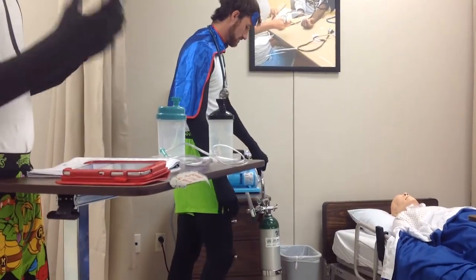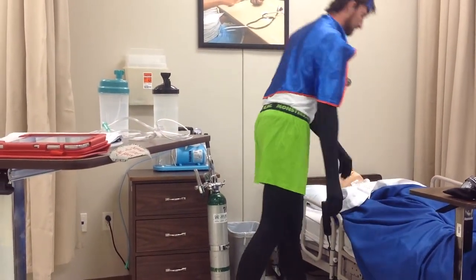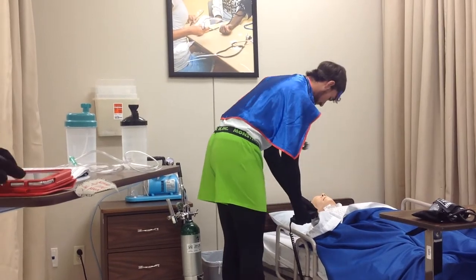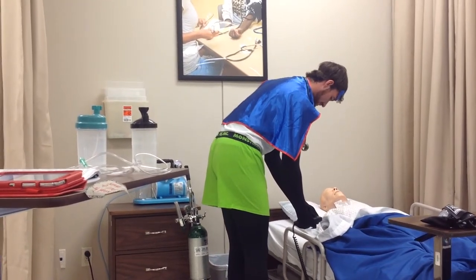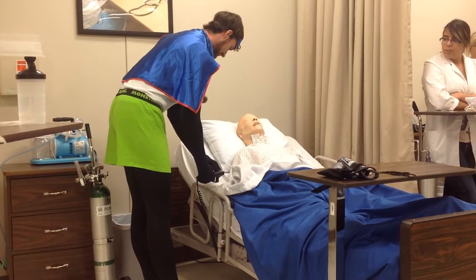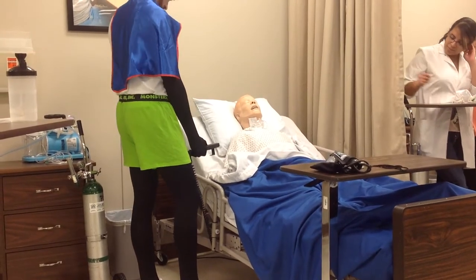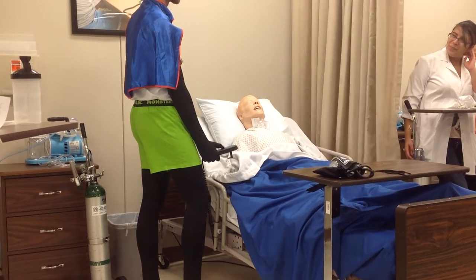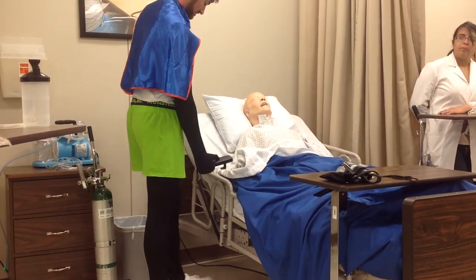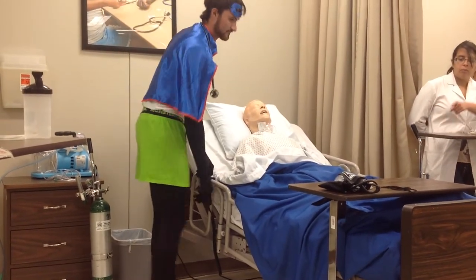So you go in your patient's room, do your hand wash, and use 2 patient identifiers. After all that, the first thing you're going to do is your full respiratory assessment with vital signs. You want to prop them up in a high Fowler's position, unless contraindicated. Your vital signs include your blood pressure, pulse ox, pulse rate, and respiratory rate, and you're also going to check lung sounds, checking for rhythm and the depth of each breath.